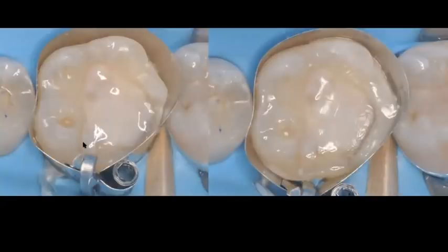Or I can decide to use a selective etch technique, but I'm still having this sealing of the dentin protecting it, so that I don't get any monomers going through those deep dentinal tubules into the pulp and creating some type of pulpal reaction. That's something, again, that we spoke about in our adhesive webinar. So go ahead and review that one if you feel that it's something you may want to review. But we're going to start now with our centripetal technique.